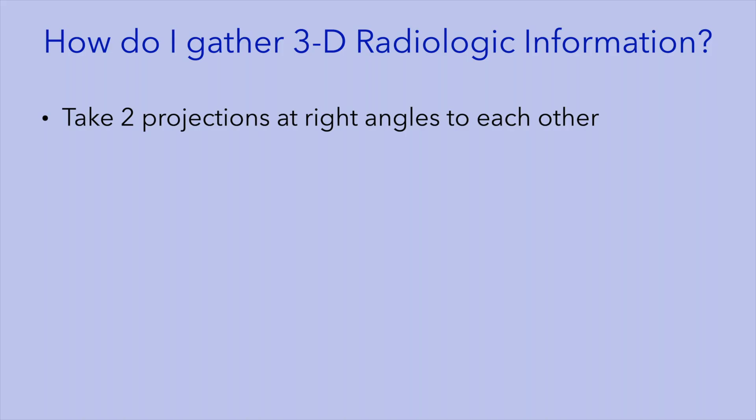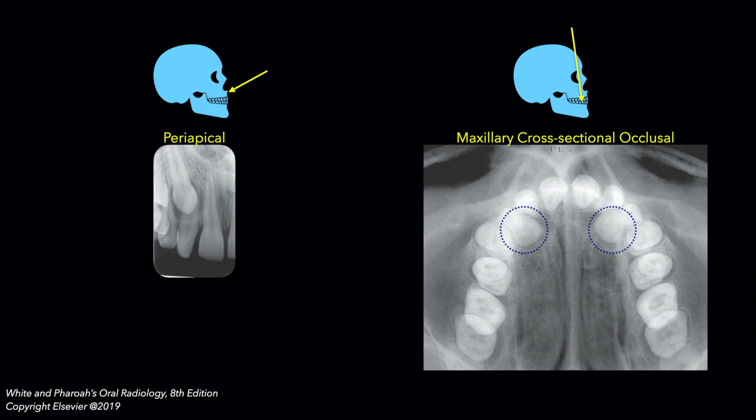A second approach to deciphering the third dimension is to take two radiographs that are at right angles to each other. In the case presented here, that combination would be a periapical and a cross-sectional maxillary occlusal radiograph. Note that the occlusal radiograph demonstrates the palatal location of the impacted canines, an assessment that could not be made on the periapical radiographs.